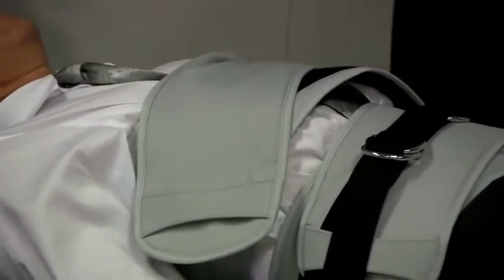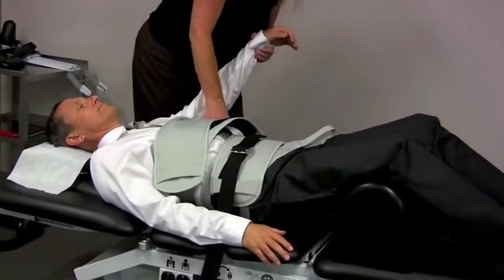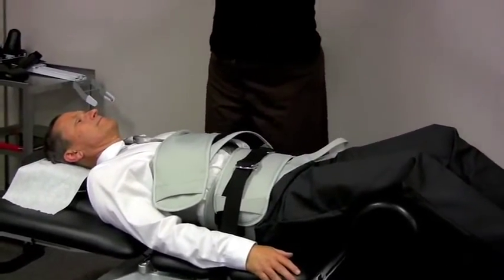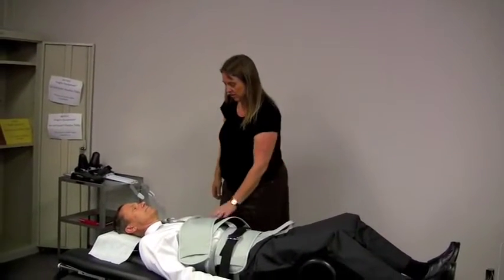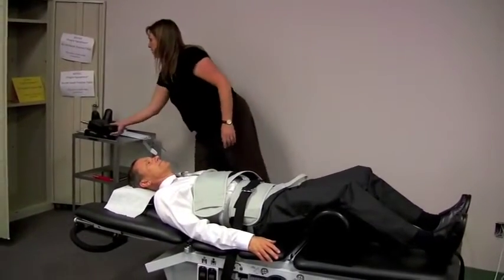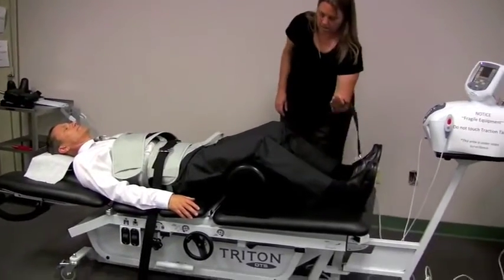Now, some patients like to have the arm piece here because it kind of cinches them in there, but some people don't like it. Some people feel they need it because it would stop them from tractioning too much. So do you notice any difference if you like that piece in there or not? I don't mind. Yeah, I'm going to take it out because I don't think you're one that has to have it. Okay, to the bottom part.